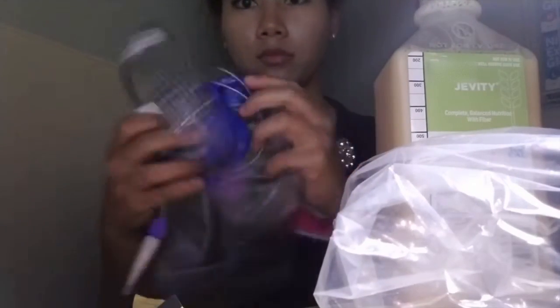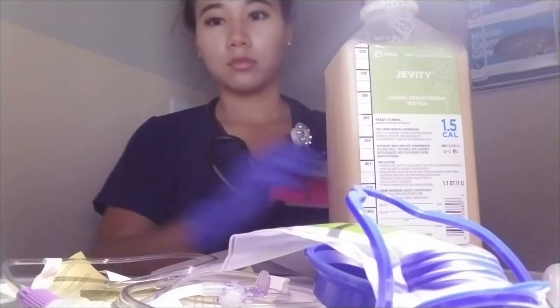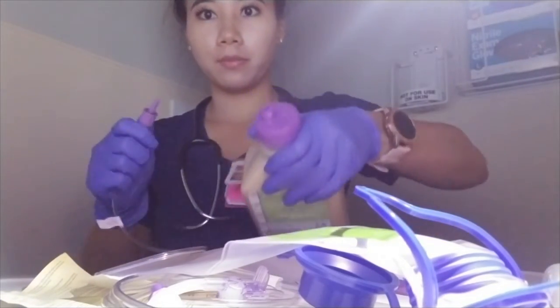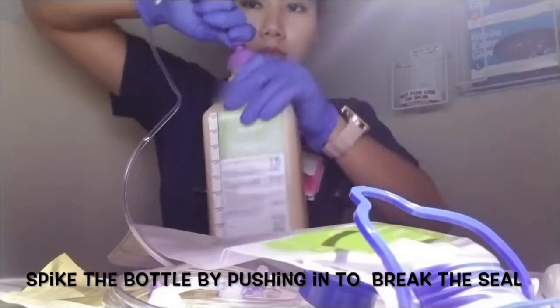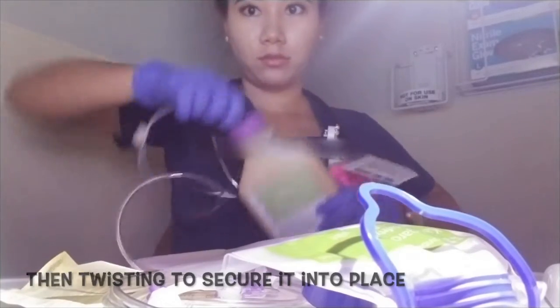I will now tear open the packaging. Put on gloves. This is what the spiking end looks like, and you can see both of the X marks match perfectly together. Spike the bottle by pushing in to break the seal and then twisting to secure it into place. Put that aside.